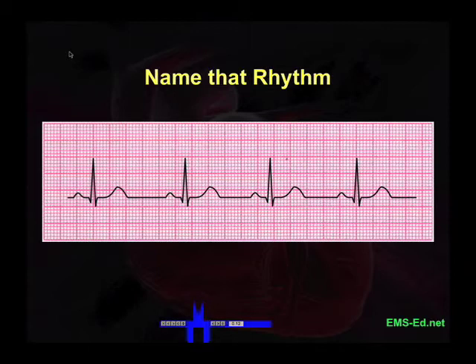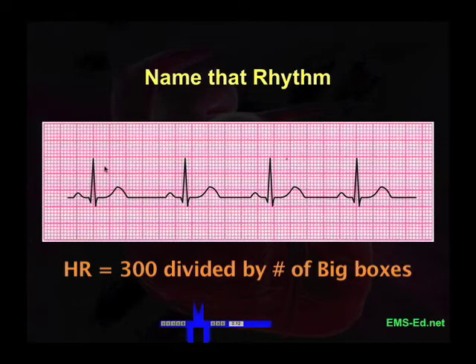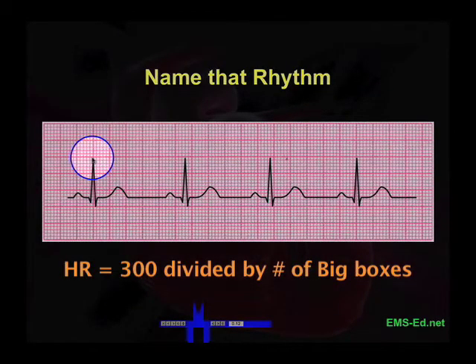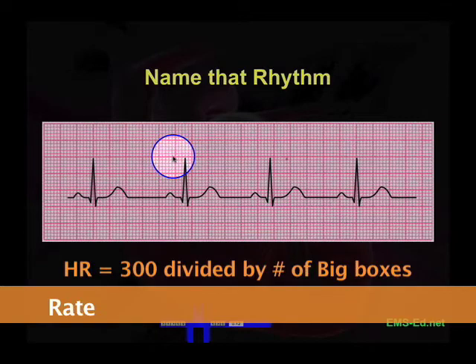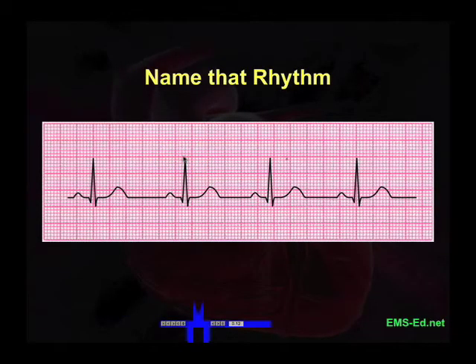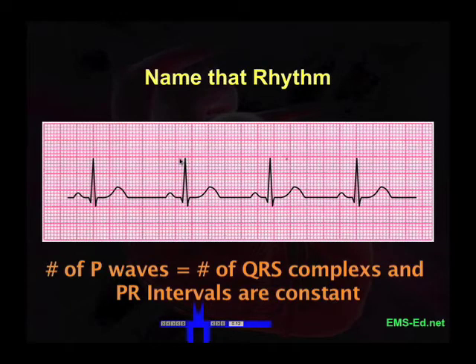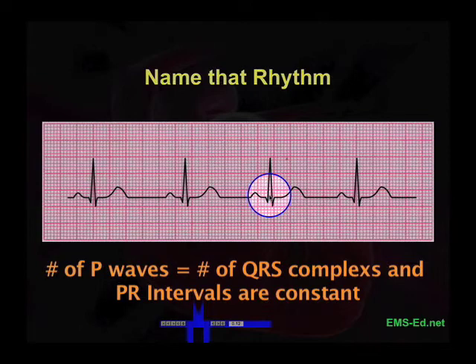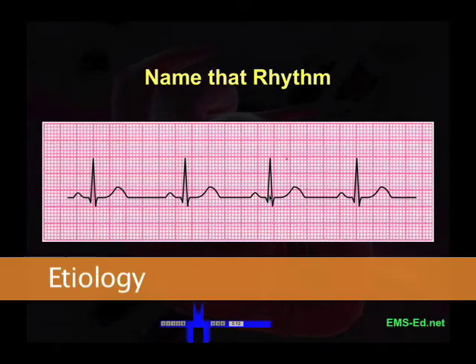This strip looks just like the last one, except it looks slower — the complexes are farther apart. Let's figure the rate. We'll find an R wave that's close to a dark line. Measuring: one big box, two, three, four, five. Five into 300 is 60, and this is slower than 60 — this would be 50. So between 50 and 60, let's call it a heart rate of about 54. It's sinus because there are P waves driving the beat, and the rate is less than 60. P wave, QRS. P wave, QRS. The P waves are clearly driving the QRS complex.